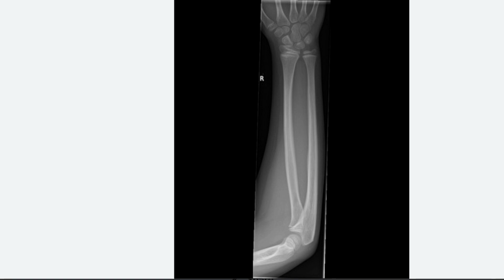So soft tissue, note swelling, density of tissue and appearance of pathological sign like calcification, foreign body and presence of air in the tissue. Bones, note the outline, density and contrast with soft tissue. As a whole, increased in fluorosis, reduced in osteoporosis. Periosteum, note the smoothness, periosteal reaction, new bone formation, lift of periosteum, thickness or bump, periostitis. Break or absence of it.